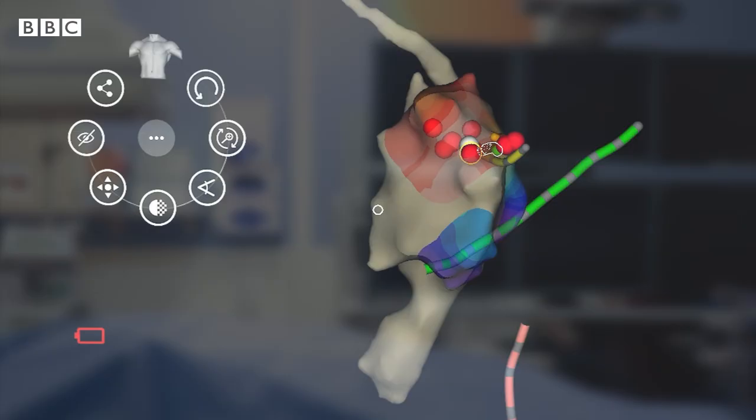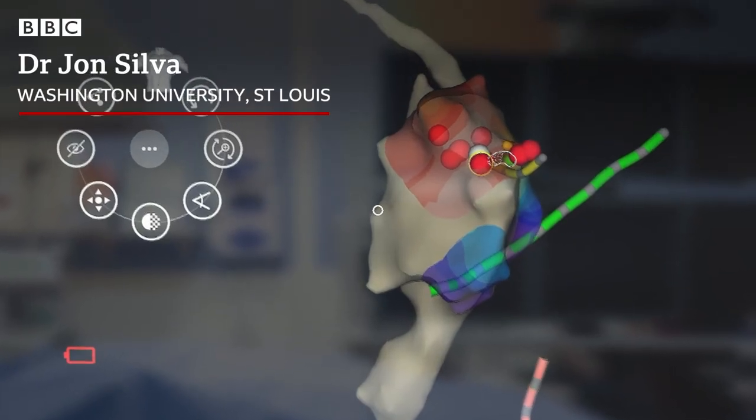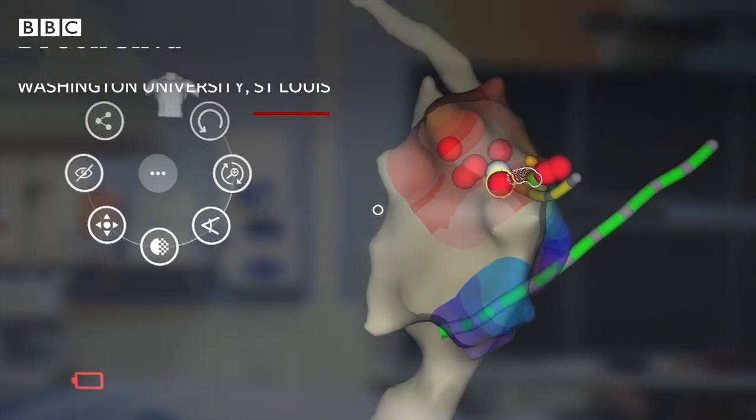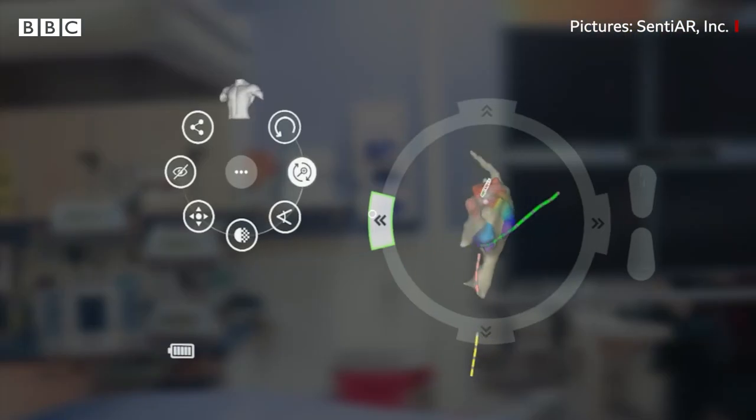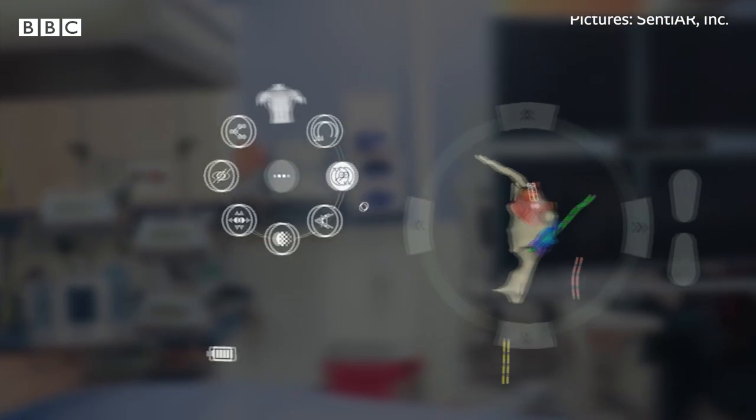We give her an idea of how the electrical signal travels across the surface of the heart. And by giving her an understanding of what pathway it takes, then she can target the exact right spot to stop the arrhythmia.